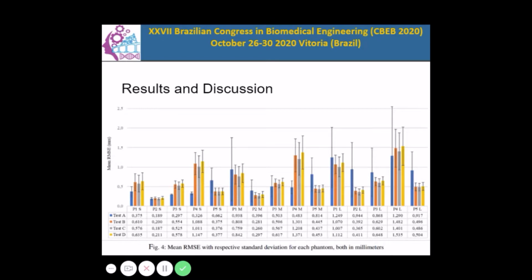The similarity measures varied considerably between patients and between defect sizes in the same patient due to anatomical variations. They increase as the size of the defect increases, as expected, because the curvature of the phantom contour becomes sharper and potentially more complex, not necessarily corresponding to the characteristic curvature resulting from the fourth-degree polynomial regression.